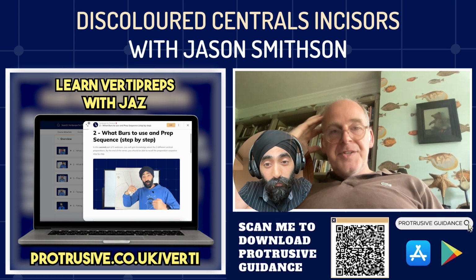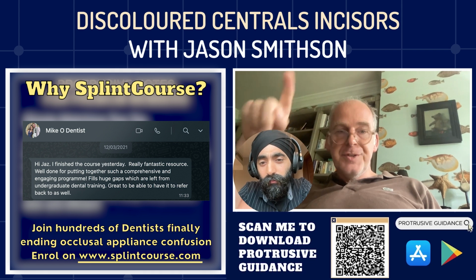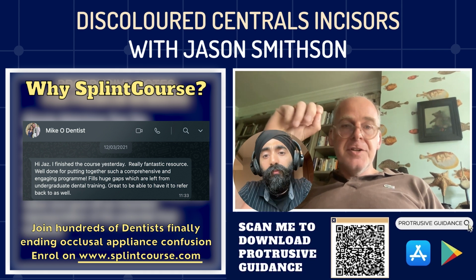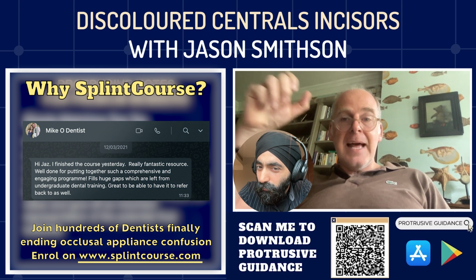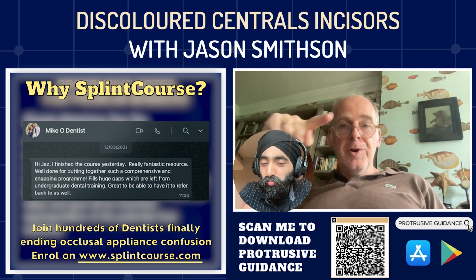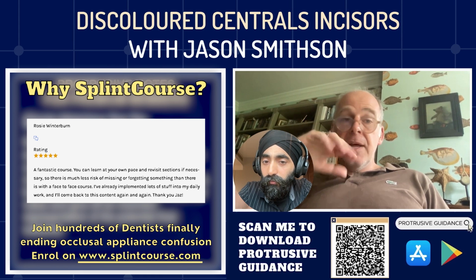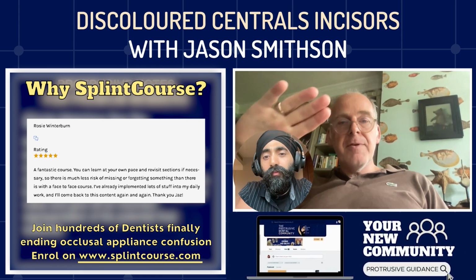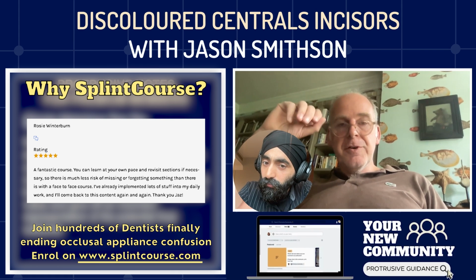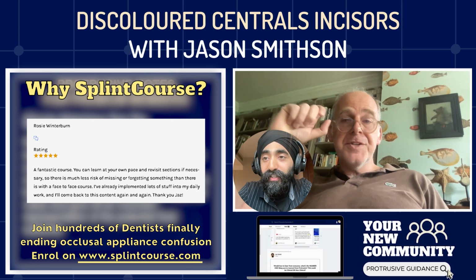The vast majority I see on Instagram and Facebook are way too thick. They're composite balls, right? Well, if you think about it, the resin you're layering is going to be in a quarter millimeter layers or less, right? So if you put a ball of 1 millimeter or 2 millimeters of composite resin on the facial of the tooth, that will give you no idea of what's going on. You need to put a very thin splodge of composite resin, not a big ball, because otherwise if you put it really thick, it increases right to the bitter end.